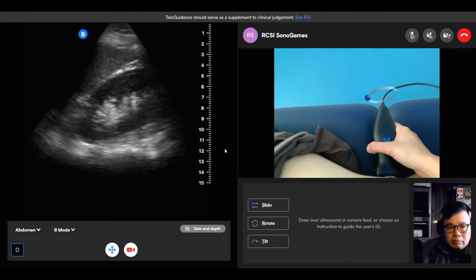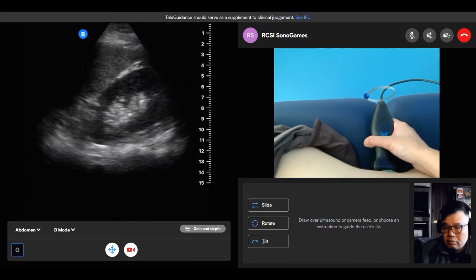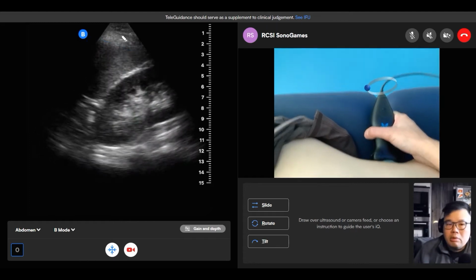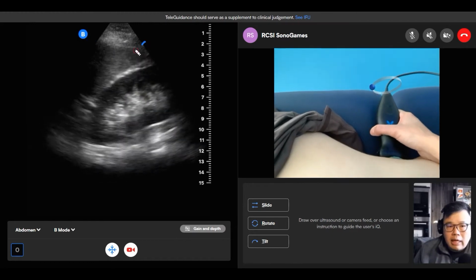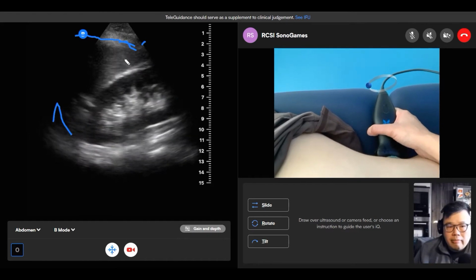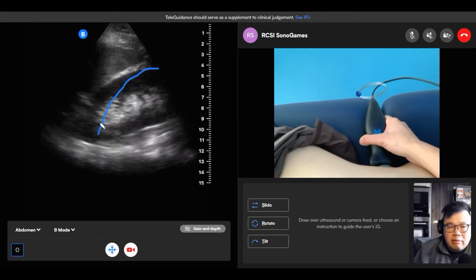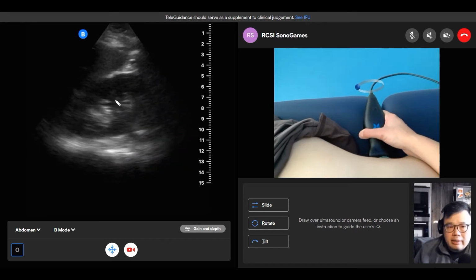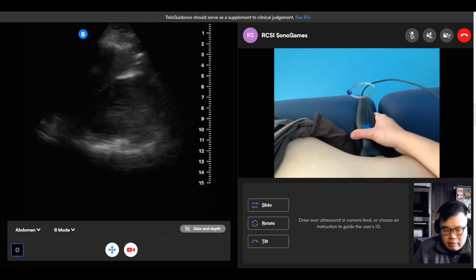So I vaguely remember that we were looking for fluid. It's more likely to be between the superior pole of the kidney and the spleen. Superior, no. So it's going to appear between the diaphragm and the spleen. Your key part here on the left upper quadrant exam is to actually look up here. Oh, so is this the infradiaphragmatic? Yes, that's correct. Because this space is actually really tight. So the ligament that holds the spleen with the kidney is really, really tight, and you don't get free fluid hanging out in there.